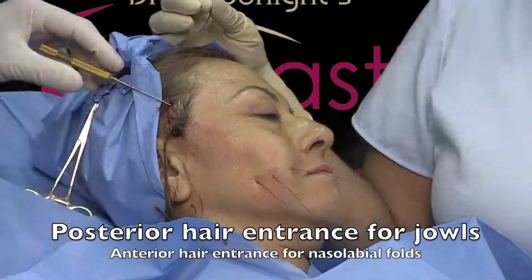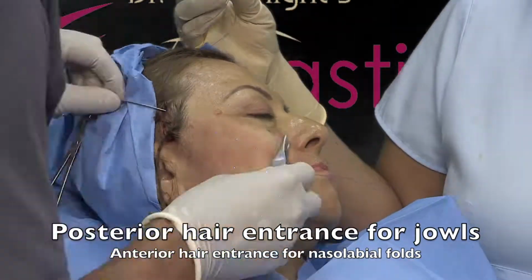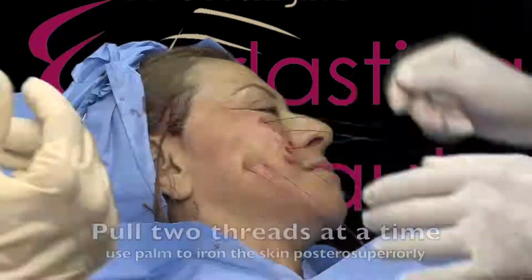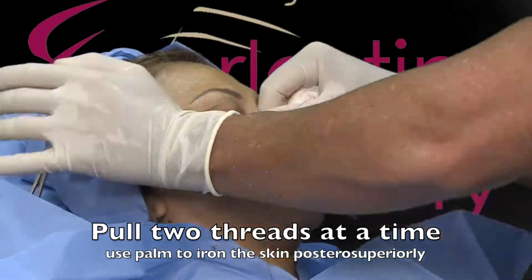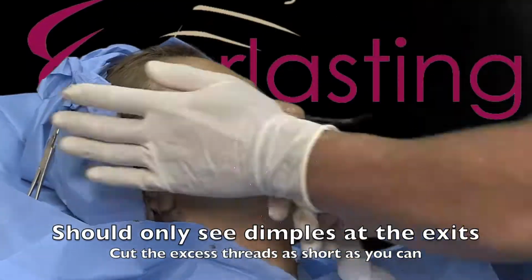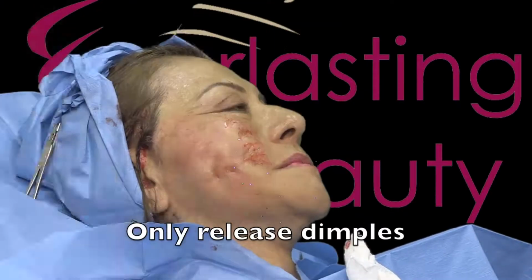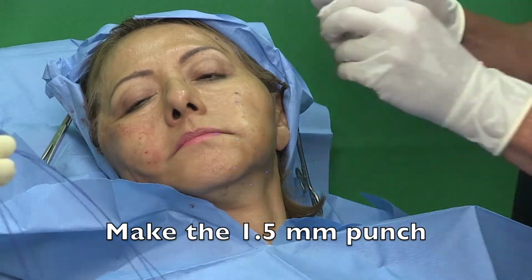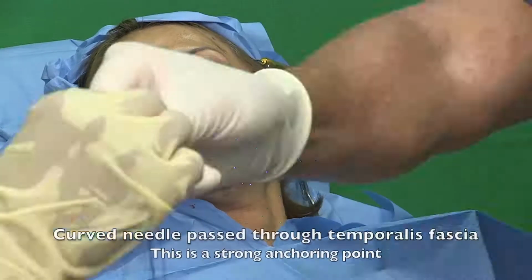To get it to go through the skin, you pull back on the blunt passer and use a little instrument to hold the skin still, such as the side of a pickups. And then you pull 2 threads at a time while you use your palms to push the skin and fat up. You cut off the exits. You should only see dimples at the exits, and they're easily released. You repeat the same process on the other side.